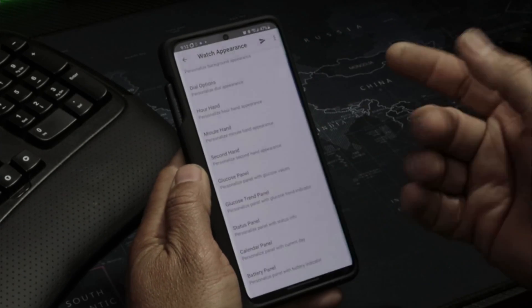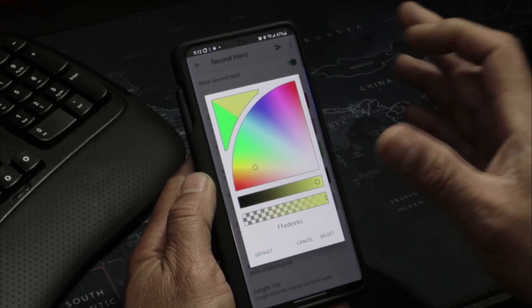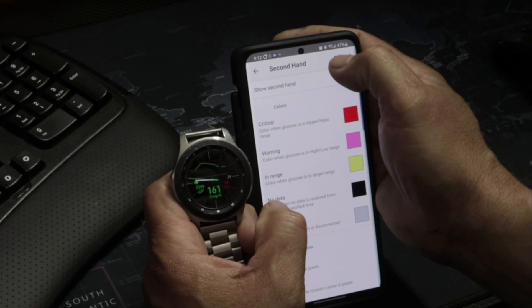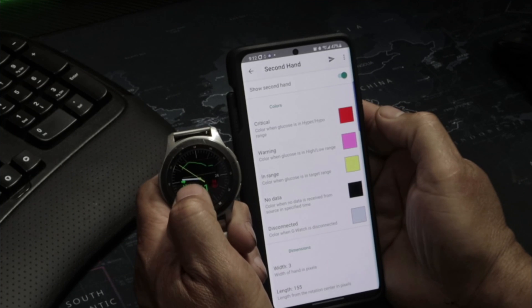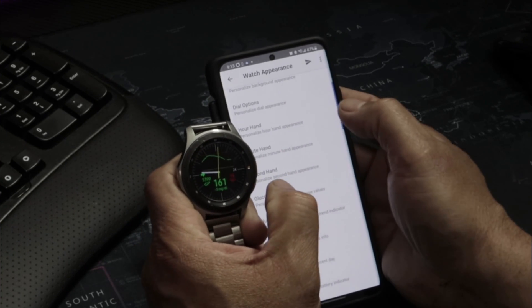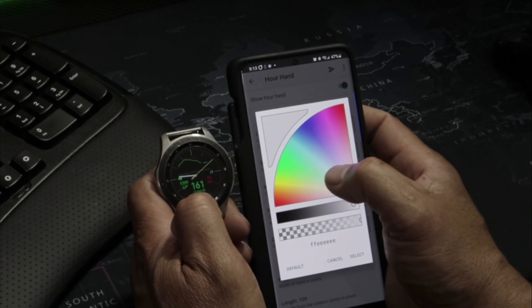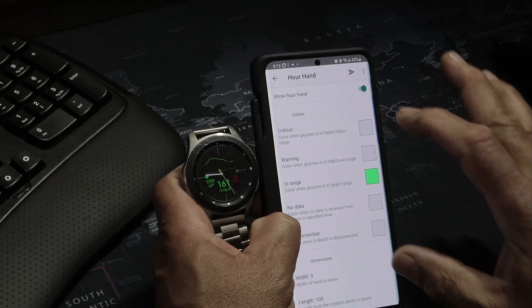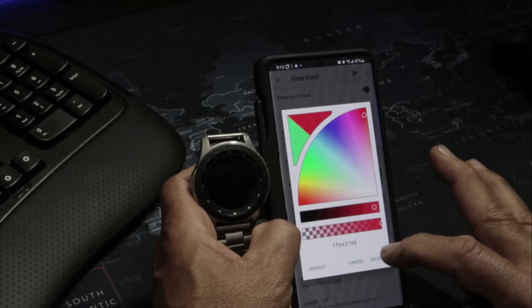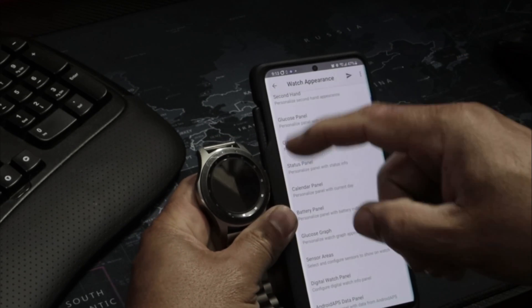For example, my second hand is green, so I'll change its color to show you. I tap on the second hand — it's currently green for in-range — and I'll change it to yellow. You can see it just changed to yellow on the watch. I'll also change the hour hand from white to green, then to red to show how it works. You can just go in here and play around with the colors.